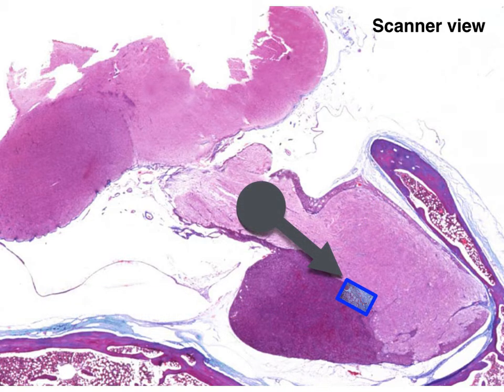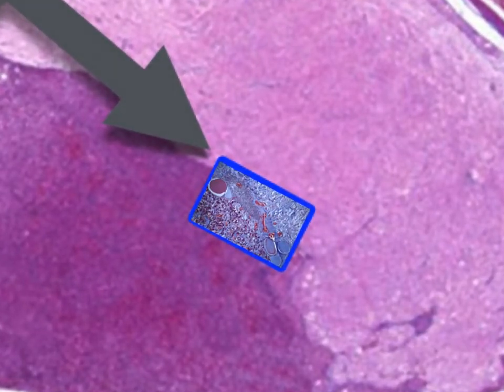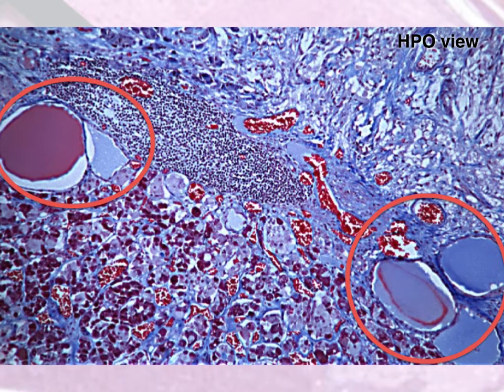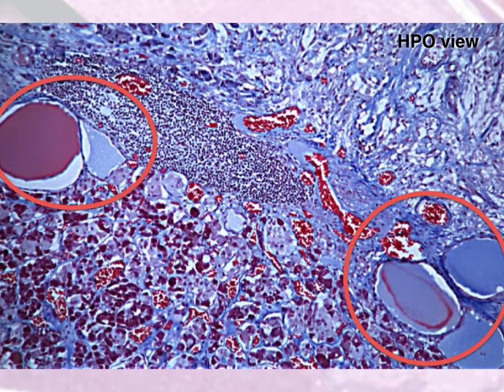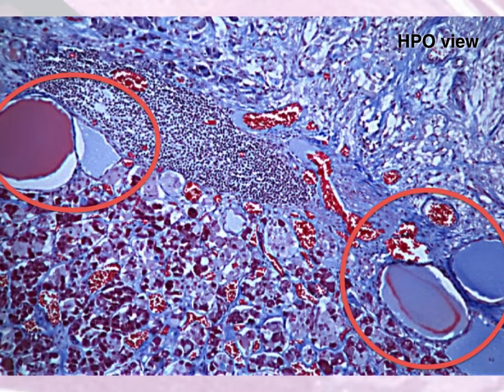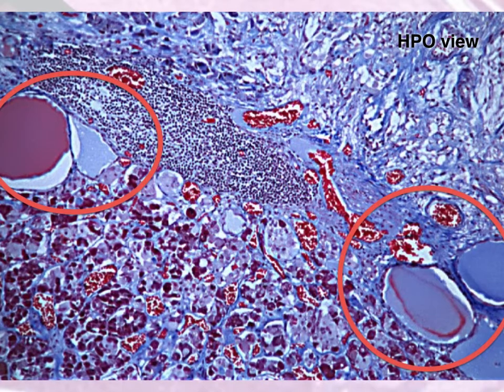Let us now focus on the portion of the anterior pituitary gland that is in intimate contact with the posterior pituitary. This is called the pars intermedia. At high magnification, we can see that this part of the anterior pituitary gland is characterized by the presence of colloidal structures. These colloidal structures are called Rathke's cyst. The pars intermedia secretes the melanocyte-stimulating hormone.